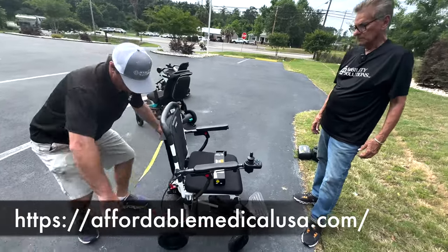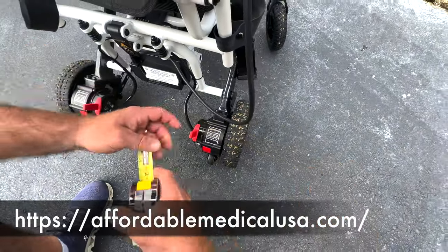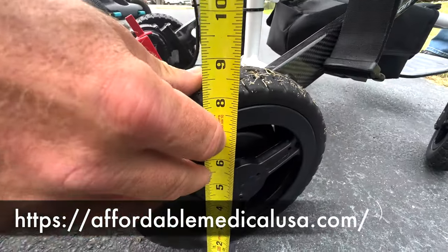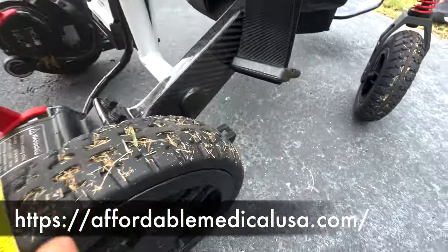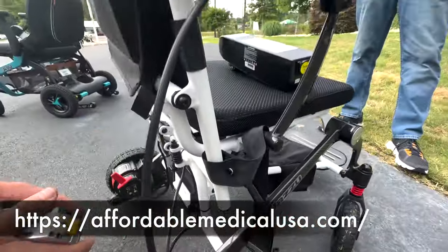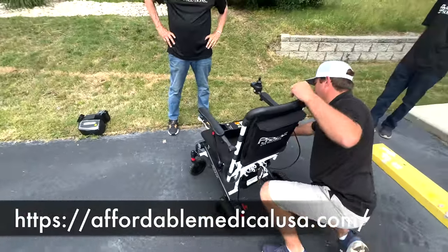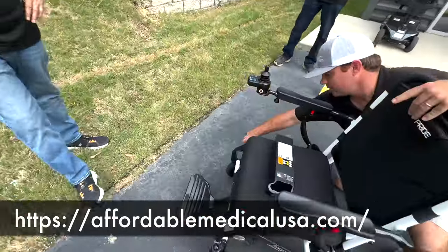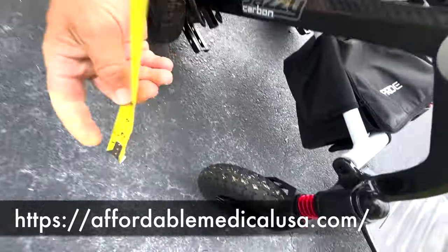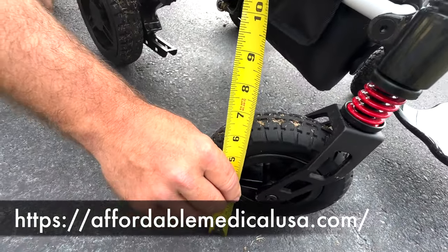Overall width, 23 inches. Height of the tire, about 8. Across the tire width, about 2. So about the same size tires as the caster tires on that. And then up at the front, a little bit less than 2. And then the height is about right about there, about 6.5. Can't see it.